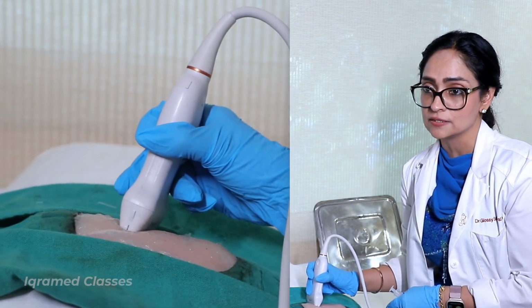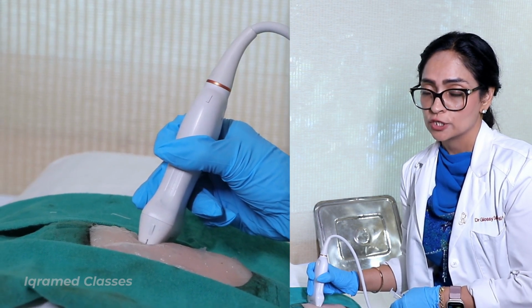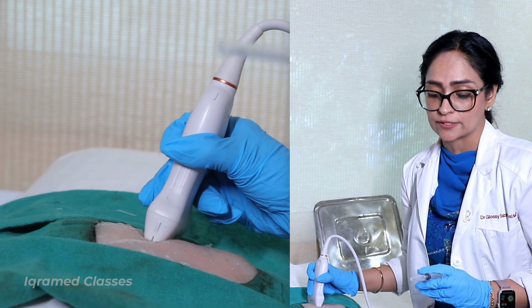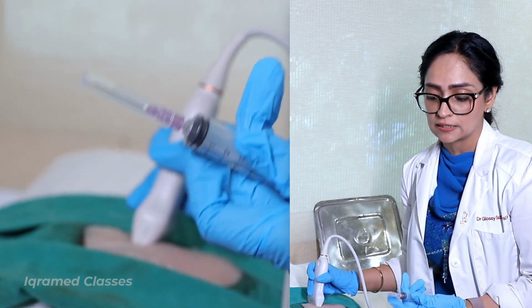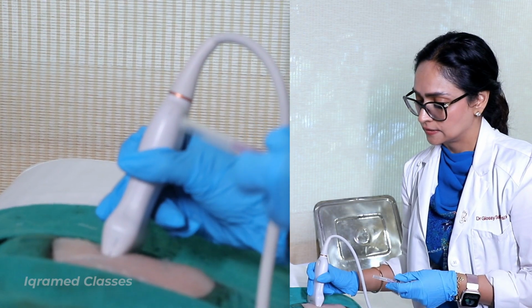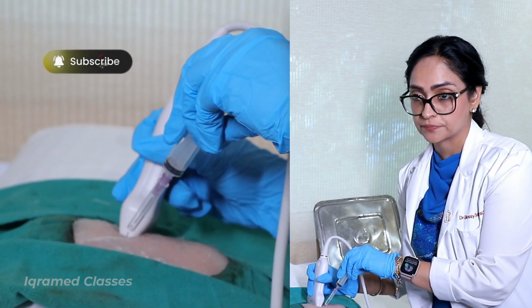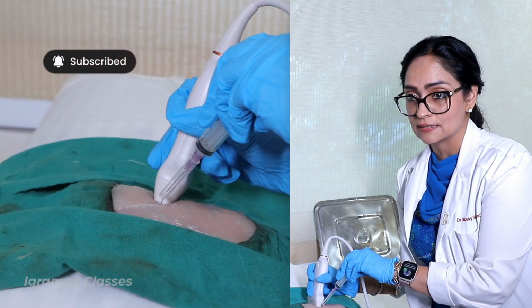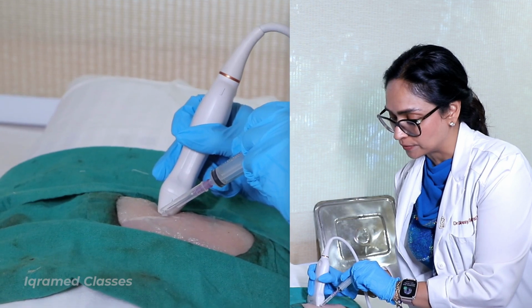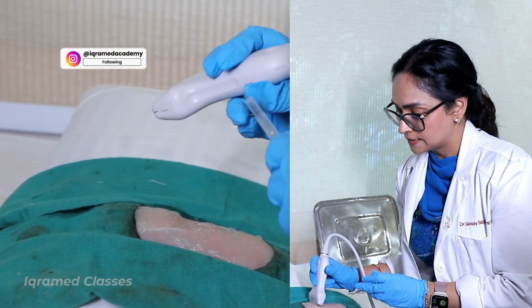It can be seen on the screen left side because this is the right of the probe. To do fine needle aspiration cytology, you have to use a needle according to the depth and you have to place it parallel to the probe. If the needle is perpendicular to the probe, then it will come as end on. Let's see how.